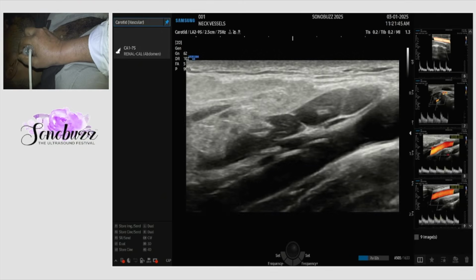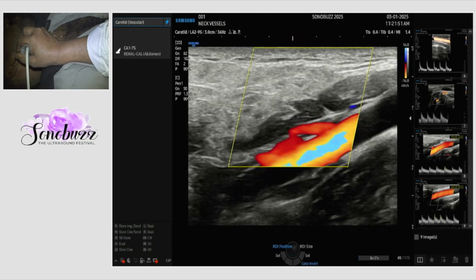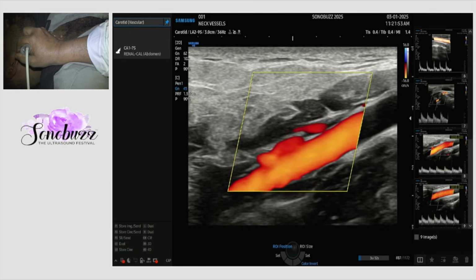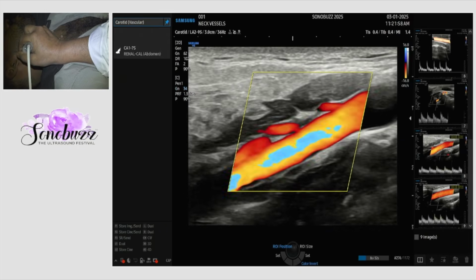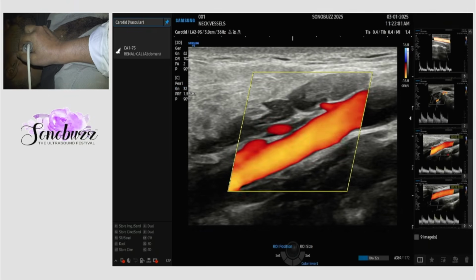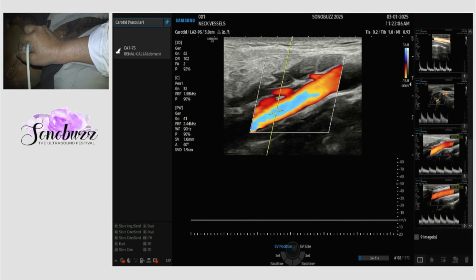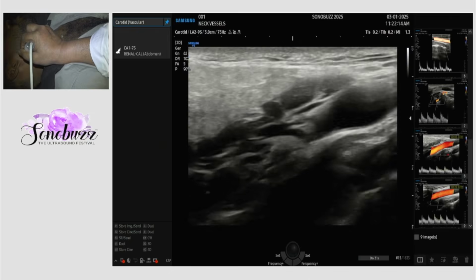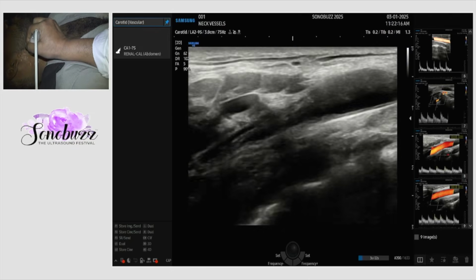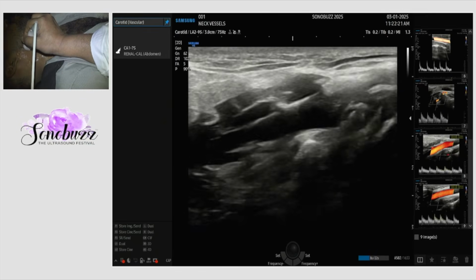If possible, we also can take one more ICA measurement a little bit distally, and that can be done in instances where there are disease processes, because proximal ICA stenosis will cause post-stenotic turbulence, which will be documented when you take a spectrum a little bit beyond. So that will be the one additional thing you can take and measure as a mid ICA level. The distal ICA per se will not be seen very well on the carotid Doppler study with the regular probe. Sometimes we use the intracavitary probe angle, and that allows you to see it beautifully.